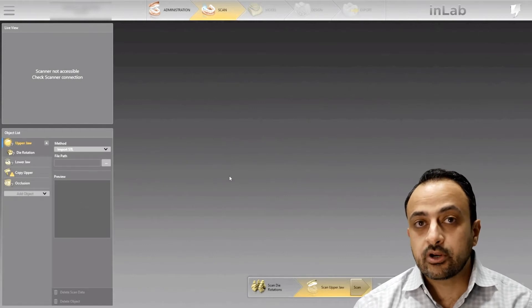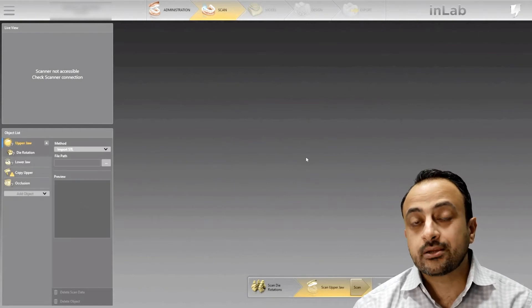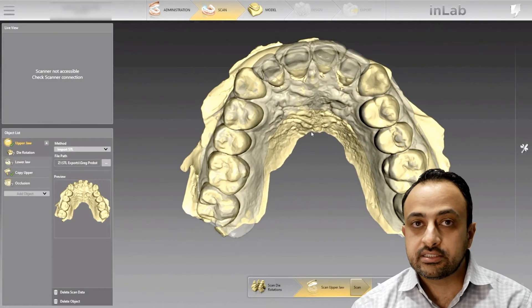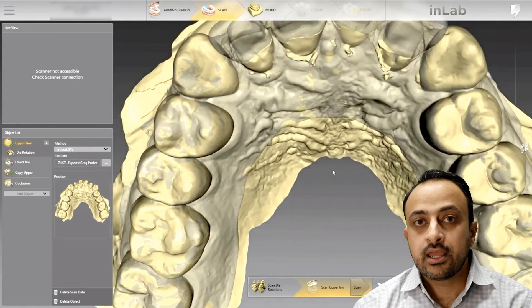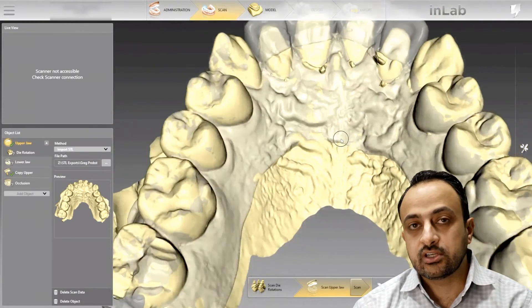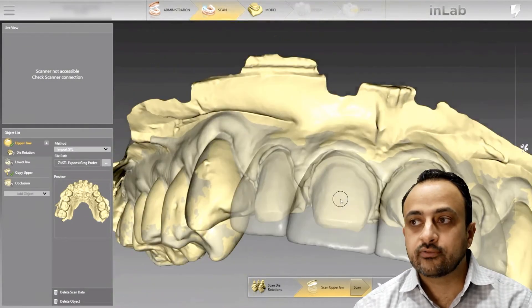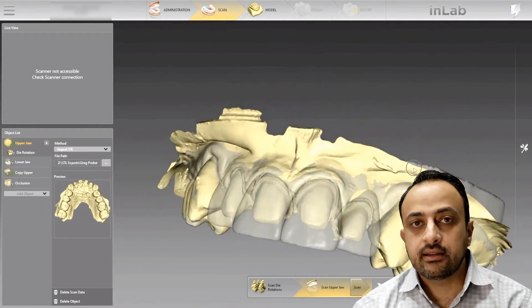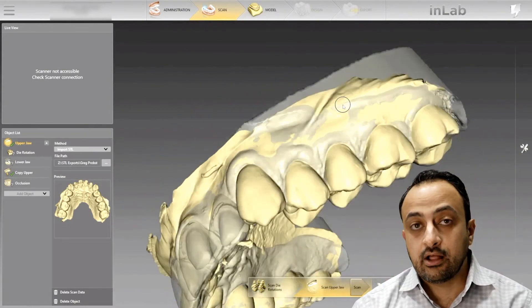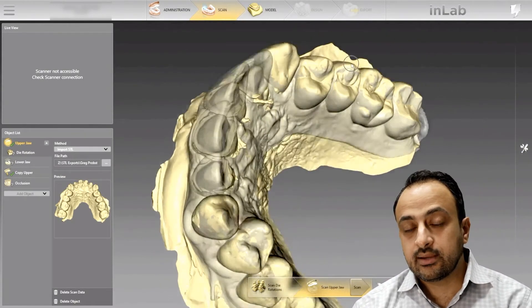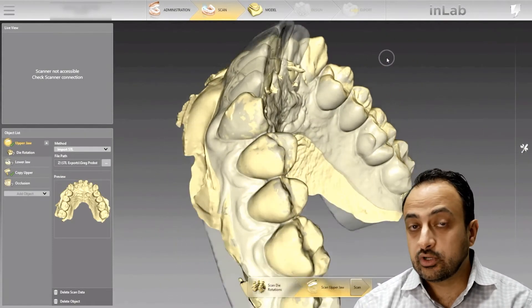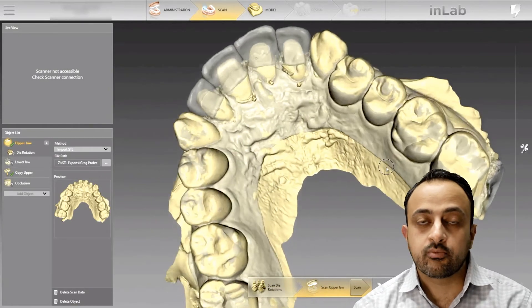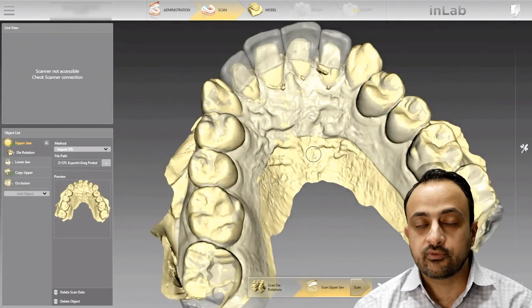When I bring in the preparations and the wax up, InLab 20 will automatically stitch them together and it will be a perfect stitch, as you can see on the screen. So I don't have to worry about bio copy data and having enough common data. The algorithms in the InLab software are extremely powerful and they are able to articulate both models in a perfect fashion.